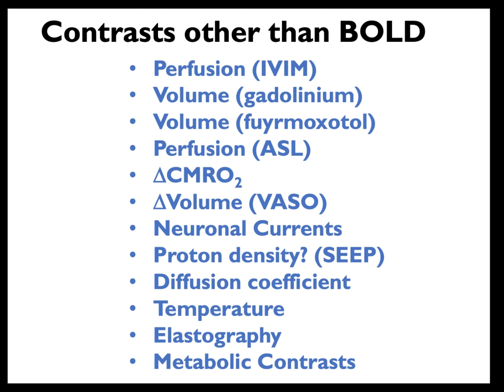Yeah, I was just mentioning, exactly, like I said, bold can't get baseline information. So definitely perfusion, blood volume, possibly metabolism can sort of complete the story. You might look for a biomarker that says, oh, this connectivity with bold is this. But wouldn't it be nice to actually be able to say also, oh, the blood perfusion is elevated in those areas too, or it's less, where the connectivity is less, or the metabolism is somehow messed up. So I think that, yes, all of this can give a more multivariate, rich view of disorders.